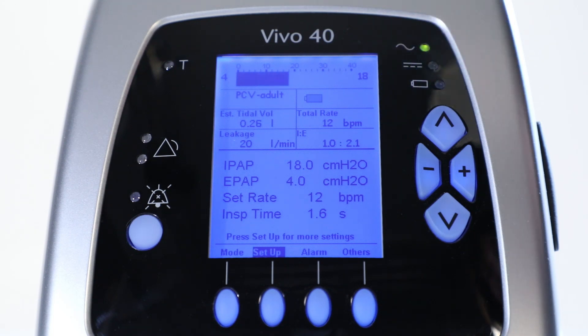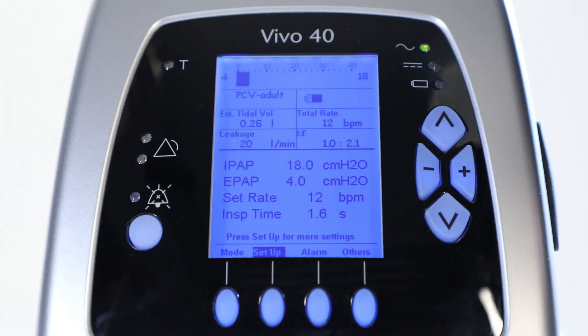The Vivo40 now tries to reach and maintain the set pressure, until the inspiration time expires or when the limit of the high pressure is reached.